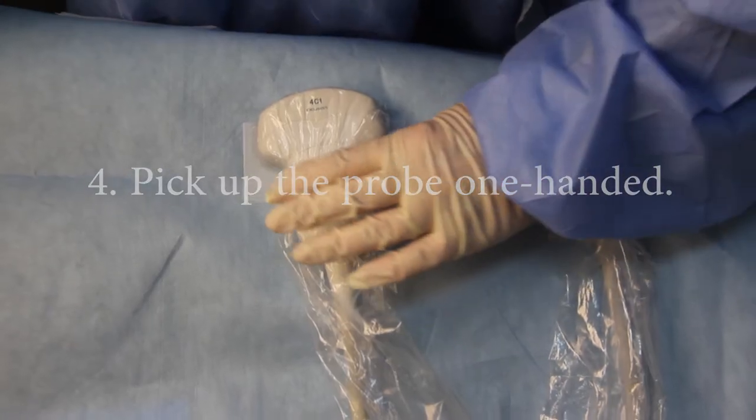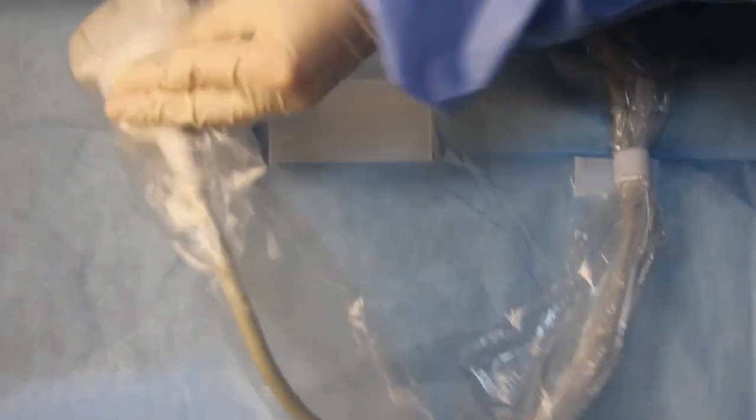4. Learn to pick the probe up one-handed by slipping your finger between the two pieces of Velcro.